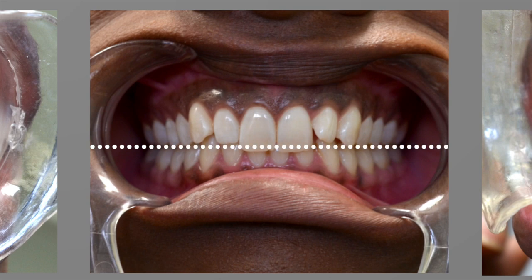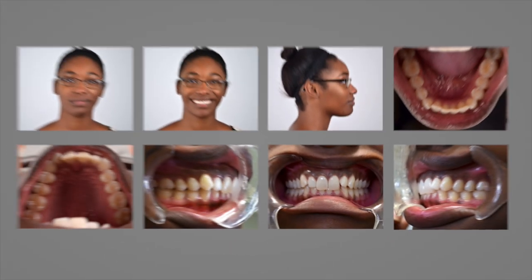Show the attached gingiva. Use cheek retractors to ensure all the necessary elements are visible. It's also a good idea to take photographs from the same eight angles after treatment. Before and after photos are a valuable educational and promotional tool.